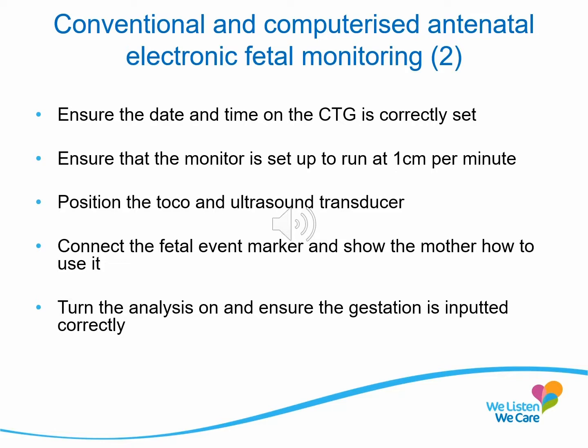Position the toco and the ultrasound transducer. Connect the fetal event marker and show the mother how to use it. Turn the analysis on and ensure gestation is inserted correctly.